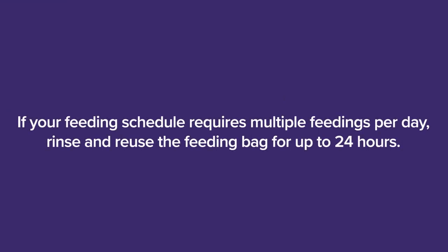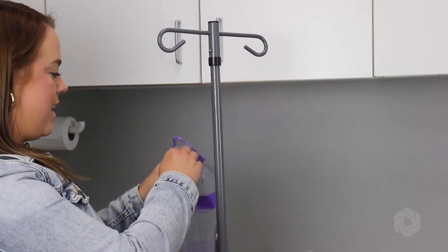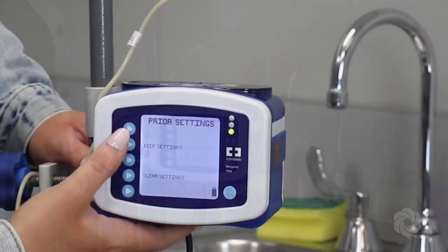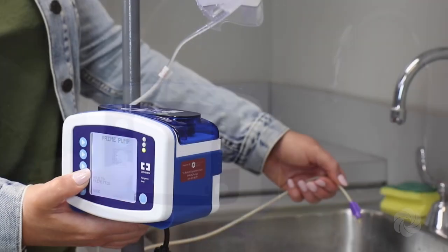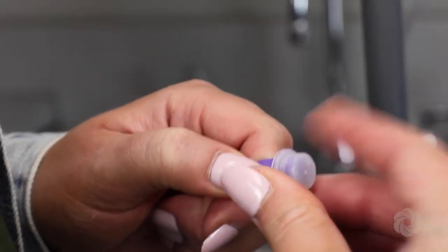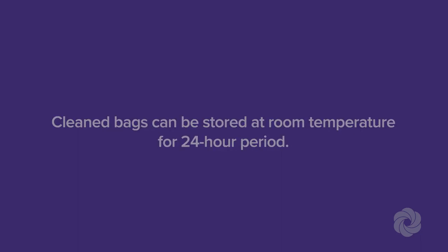If your feeding schedule requires multiple feedings per day, rinse and reuse the feeding bag for 24 hours. Ensure the feeding bag is disconnected from the feeding tube. With the feeding bag still loaded in the pump, open the lid to the bag, add lukewarm water, and close the lid. Turn the pump on, select keep settings, then hold down the prime to feed button to allow all the water to flow through the feeding bag. Hold the end of the tubing over the sink or garbage to discard. Once all water has run through the tubing, replace the cap on the end of the tubing to avoid contamination. Repeat this step as many times as needed in a 24-hour period. Cleaned bags can be stored at room temperature for a 24-hour period.